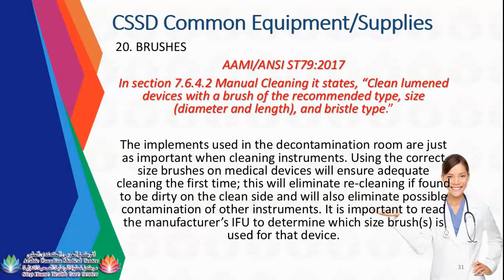So, it is important to read the manufacturer's IFU to determine which size brush is used for that device. Actually, as you can always hear, manufacturer IFU, medical device instructions, it is very important. Because we, as CSSD technicians, will just follow what the manufacturer said to be the cleaning process or protocol of each instrument. We will not clean the instrument as per our knowledge. It is as per the manufacturer's instructions for use manual.